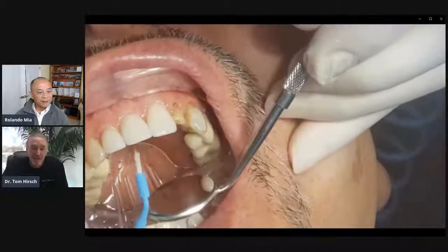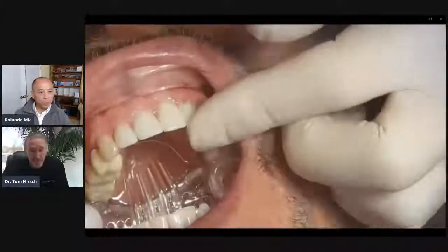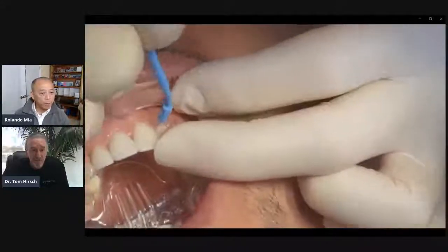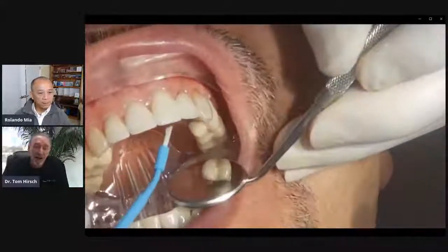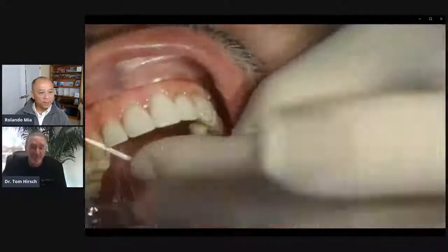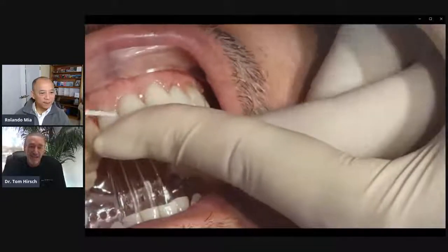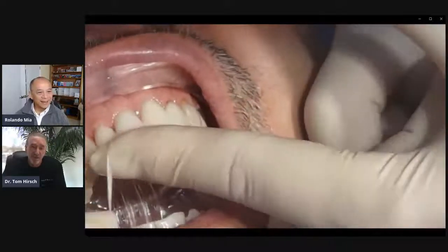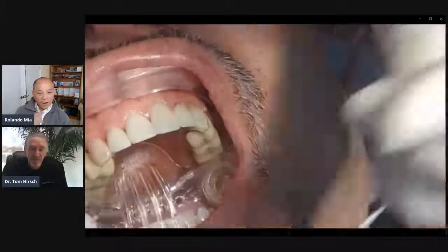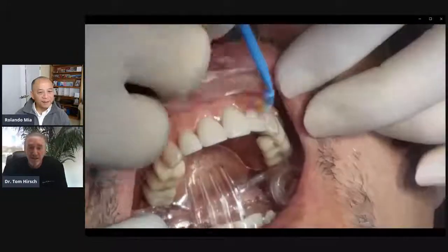Dr. Hirsch, predictability — we've heard that's important. How does this help in maintaining that, making your case more predictable? The thing is, I know that if the lips are up and out of the way and I can concentrate on my preps without worrying about things going down the throat, it's just an easy, predictable situation. It's going to be the same thing with minor variations every time. Even though the camera's sped up, I'm just not rushing. I take all the time I want to get all that cement off and clean it up.